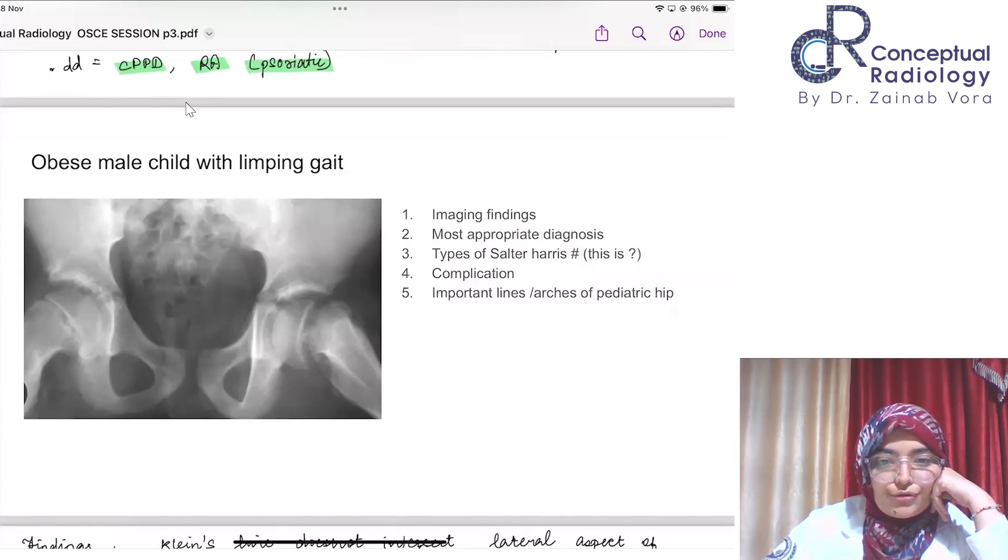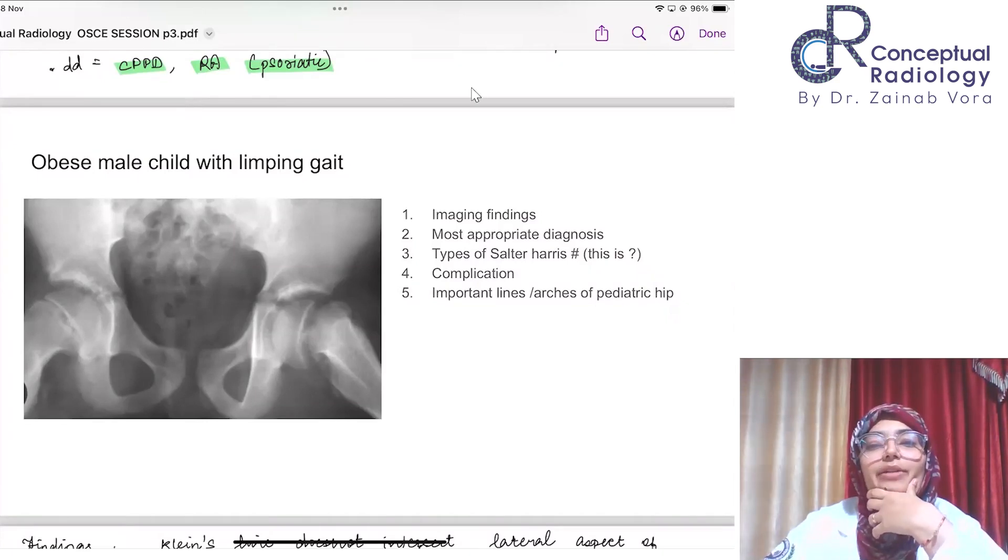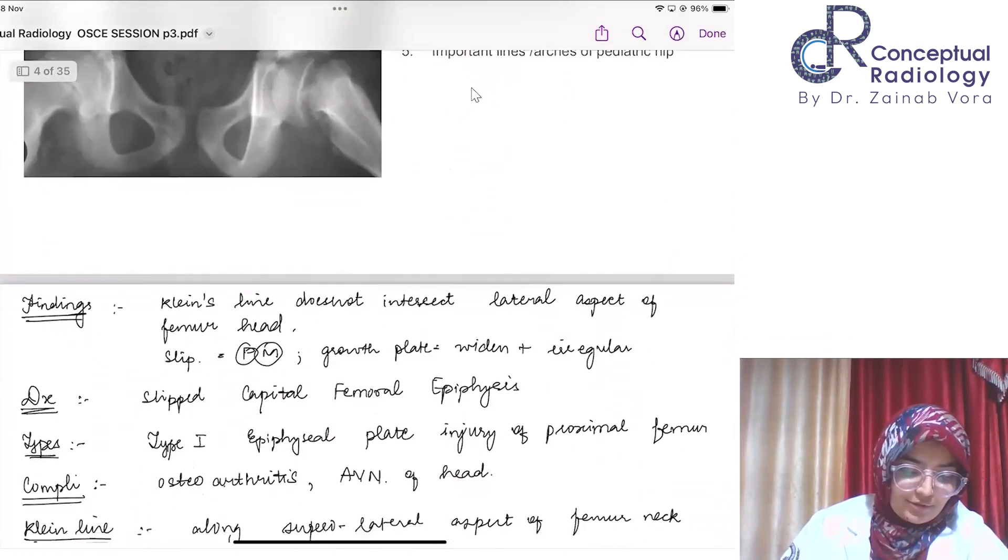Trethowan sign, Klein's line. Rithvik Sahu has answered very good, some difficult lines also: Perkin's and Hilgenreiner and Shenton's arch, very good. Shenton's line, growth restriction, osteoarthritis, and avascular necrosis. You guys have given me all the correct answers, so kudos to you. Let's see it one time. What are the findings?